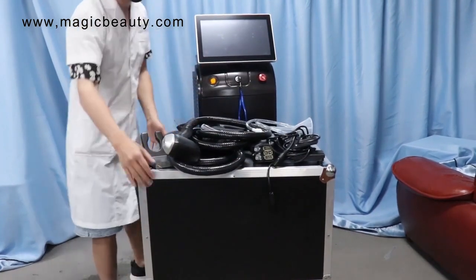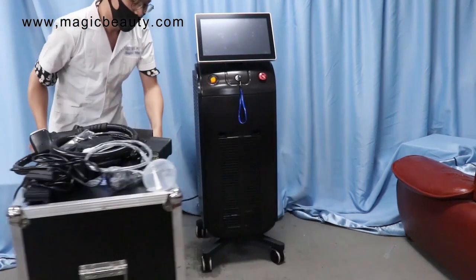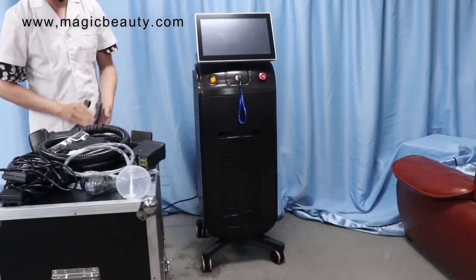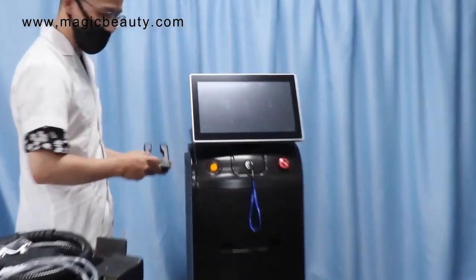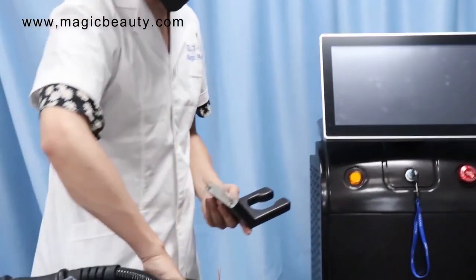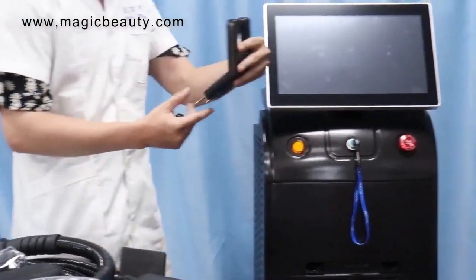So the first step, we make the installation for the handle pieces. You need to add the handle pieces. The handle holder comes with the screen for both different sizes, so you have to find the right size.